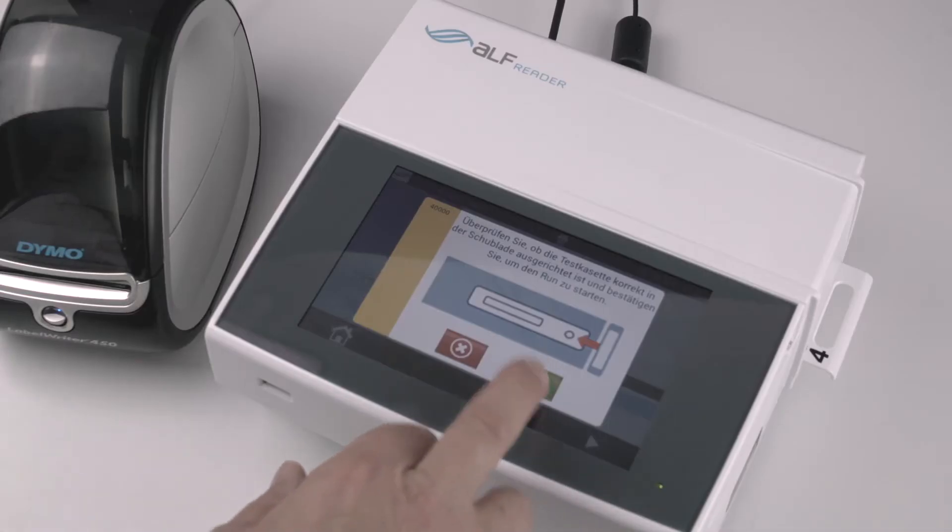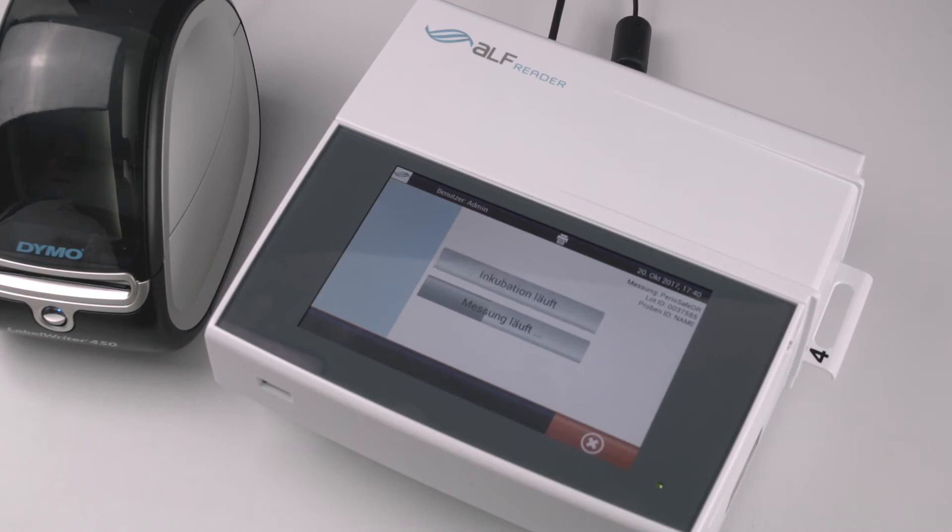Then push the cartridge all the way into the Auralizer and immediately start the analysis by pushing the green button on the screen. After 300 seconds, the Auralizer will automatically display the result on the screen.